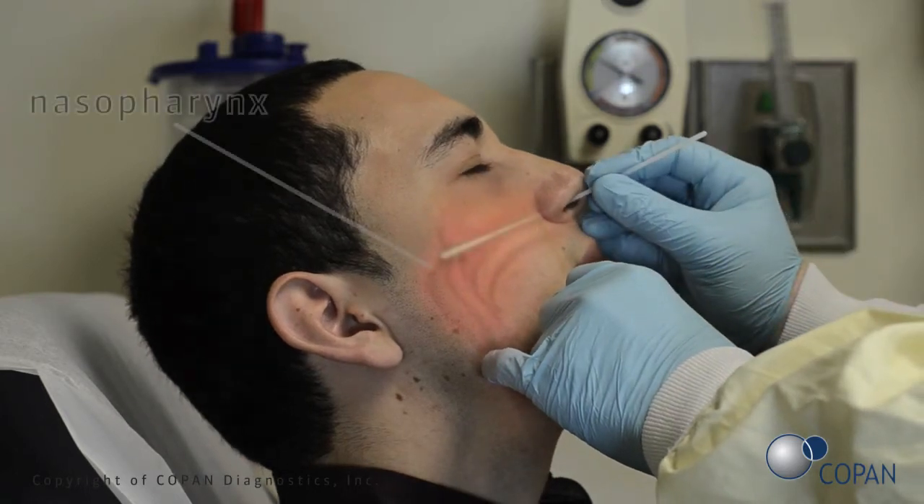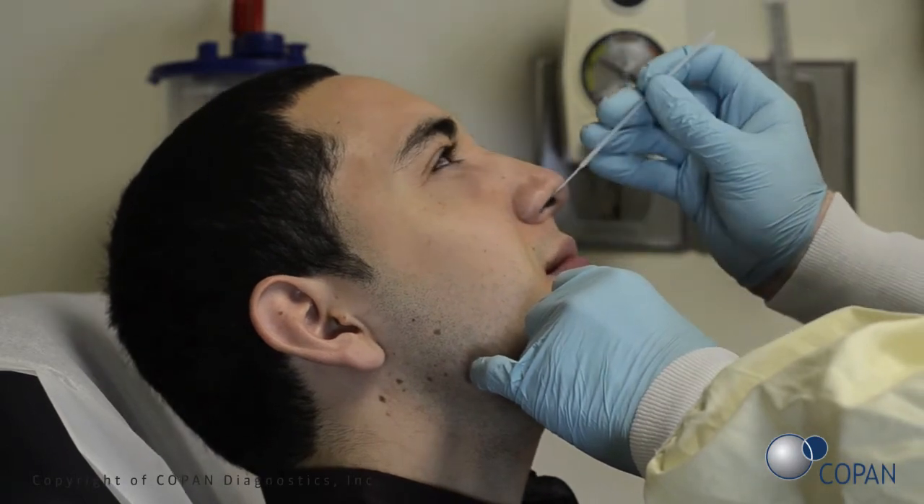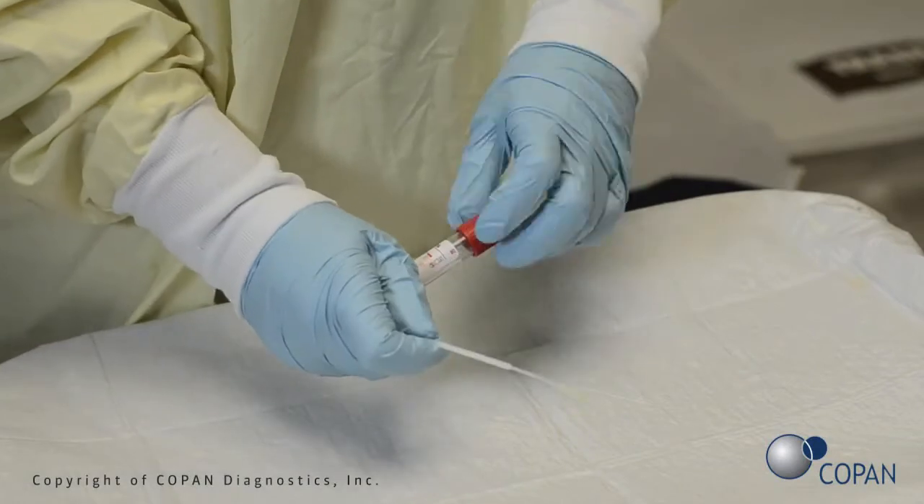As a visual reference, the swab should be inserted about half the distance from the opening of the patient's nostril to the ear. Rotate the swab several times. Gently remove the swab and perform the test according to the manufacturer's instructions.